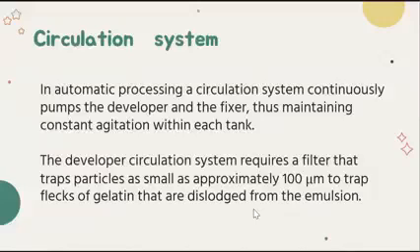Of course, your gelatin can also be deposited in the rollers, which can also harm the quality of the next films that you will process. And agitation is necessary to continually mix the processing chemicals and maintain a constant temperature throughout the processing tank, because if you do not circulate, mix, or agitate your chemicals, okay? So that means it is like the water in the sea.